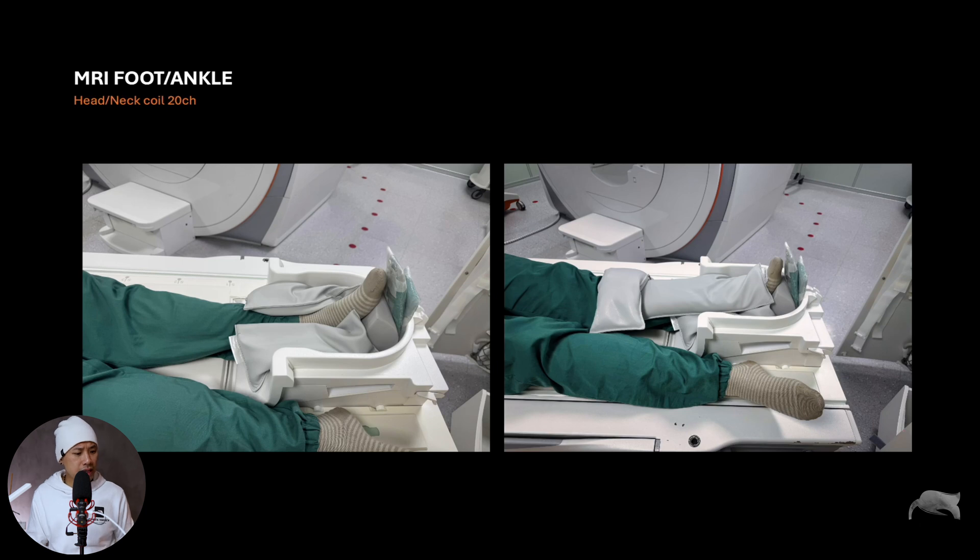I'm very surprised that this coil position provided such good images. Of course, without the DRB or deep learning you would need to invest more time, but with DRB the results are amazing. You might ask whether you even need a dedicated or flex coil — but you should still buy one, because with a dedicated coil it's more reliable. Every radiographer will position it the same way each time. With this head coil approach, there may be more variation between operators and between time points.